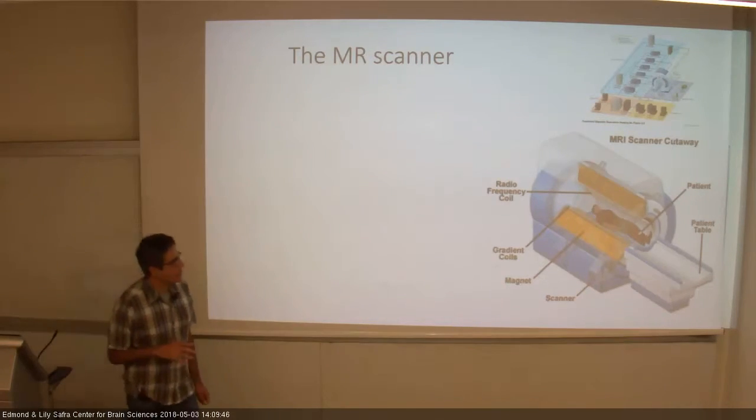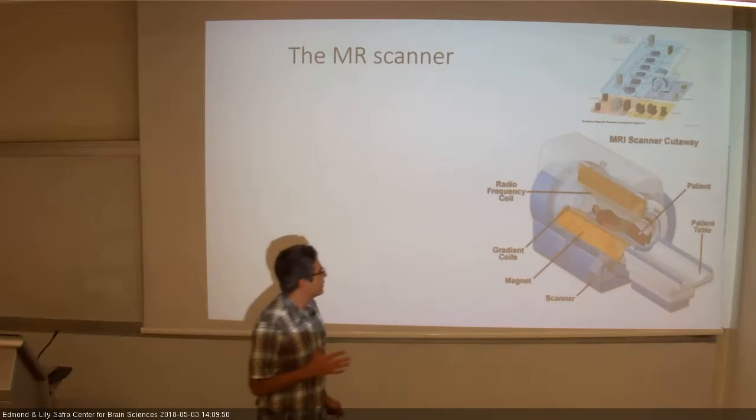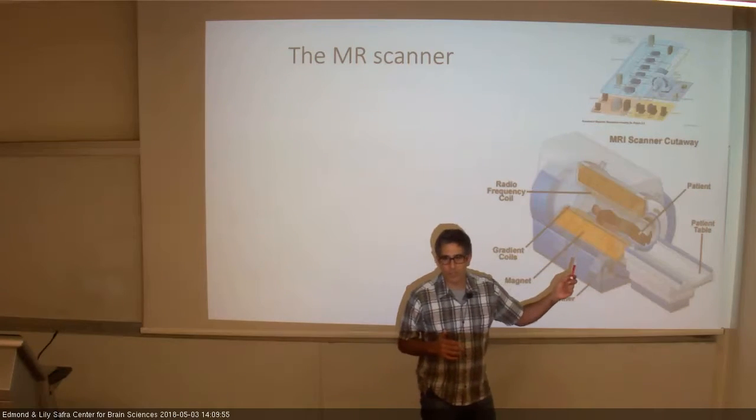So what is MRI? It's a huge magnet. Okay. So typically, it's like a big tube. Is anyone here who never saw an MRI?